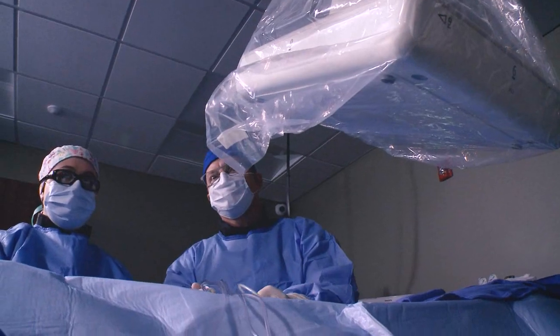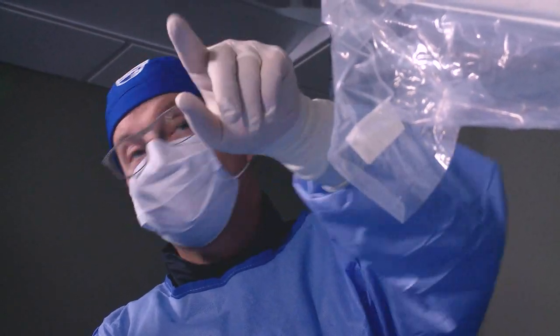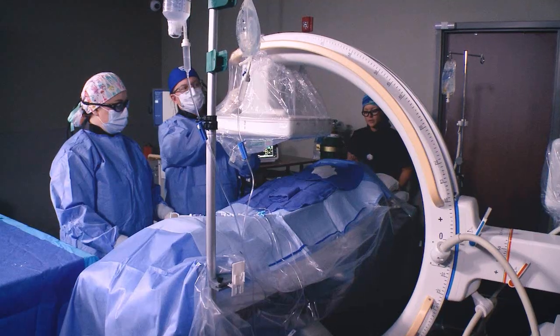One of my greatest concerns was being able to deliver a quality product in an office-based setting. I'm very used to and was trained on a fixed unit in a hospital setting. I was only going to do this adventure if we could guarantee that the imaging would be equivalent to what we could get in the hospital.